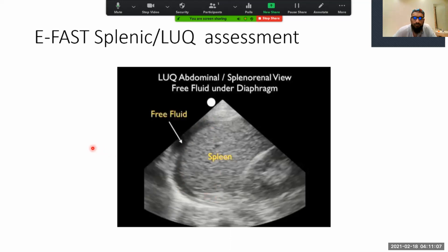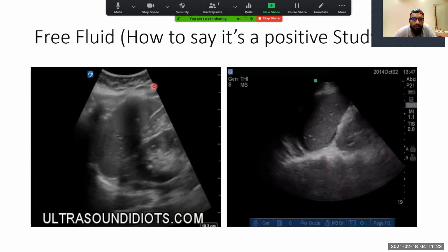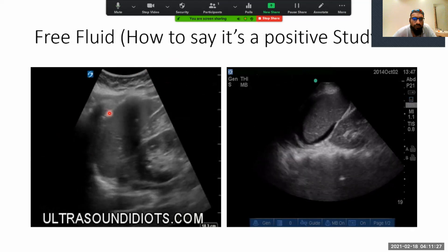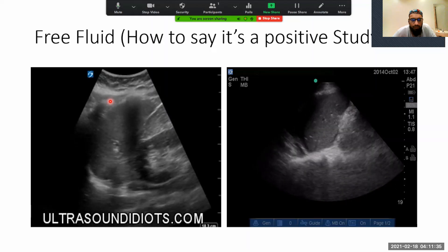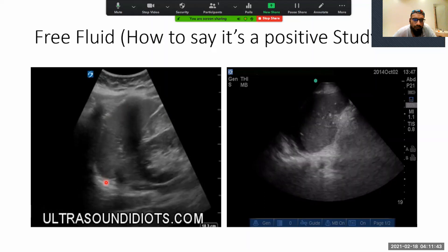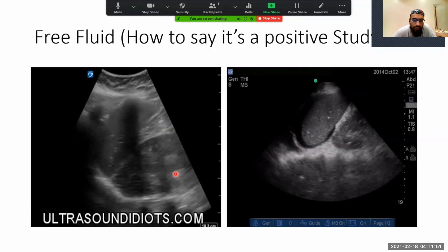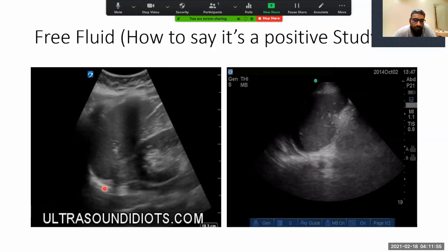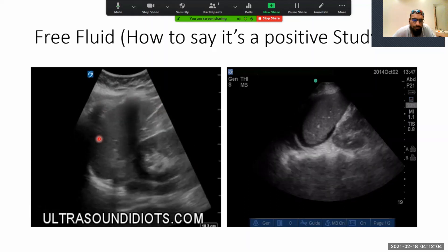Okay, I hope you enjoyed that — it's quite a nice one, and once you get used to the splenic views you can learn quite a bit. So we're going to try a few practice cases now. We need to say: is it a positive study or a negative study? This is where it can get difficult with the spleen because of rib shadows — you have to do what I call rocking, where you move the probe back and forth and sway it to get in between. Here we see a spleen and a kidney, the diaphragm, and the spinal stripe, but notice there's no fluid above. So this is a negative study — no evidence of free fluid.